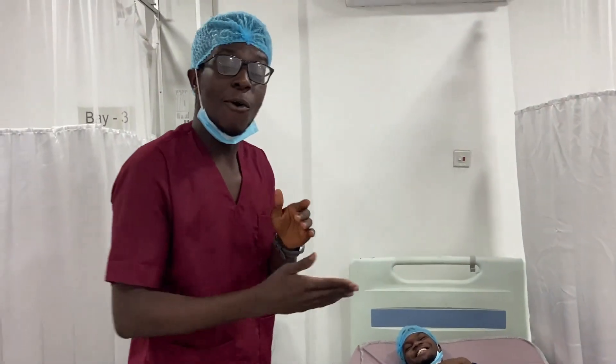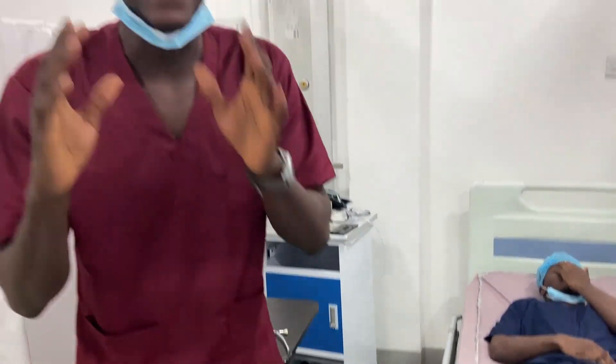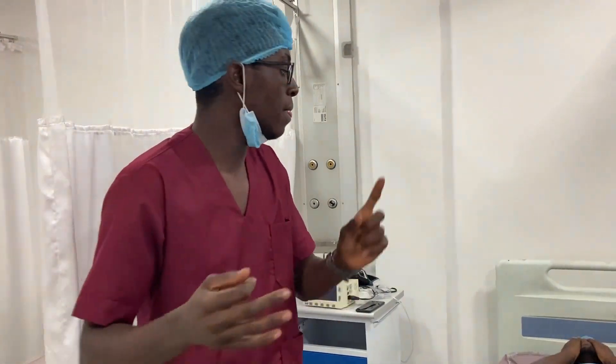Before you perform any procedure, note that vital signs — remember this for your CNO exam — it is a TRIP procedure. What has to be there: your sphygmomanometer for blood pressure, a stopwatch or timepiece to check the pulse, a thermometer for the temperature, and a stethoscope to hear the Korotkoff sound.